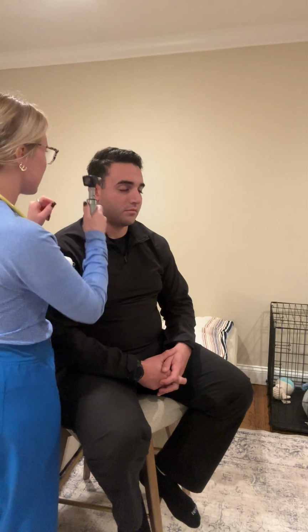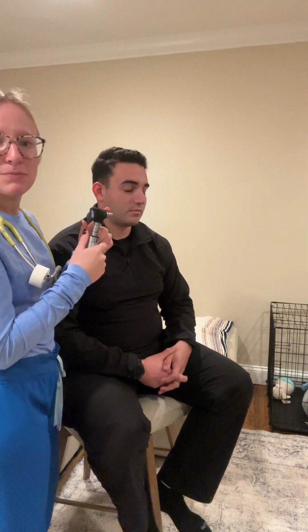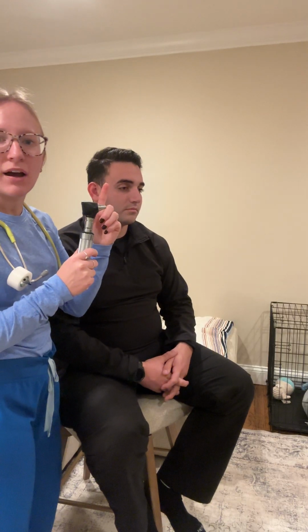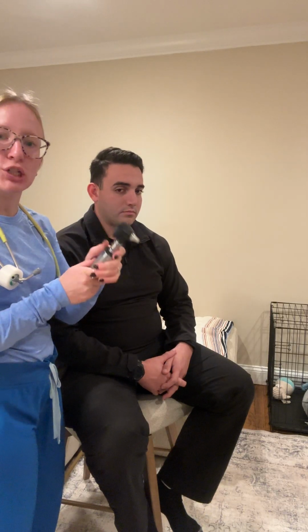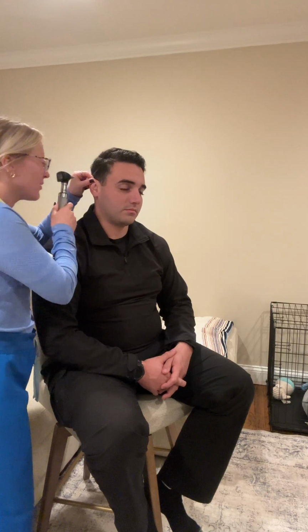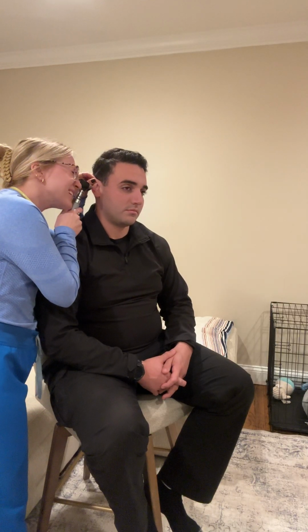So for the sake of the video, we are going to use our otoscope, and we are going to use the largest speculum. That way it gives him comfort, but we're not going to shove it into his ear. We're going to very gently place it in. So, like I said, we're going to pull up and back. We're going to view the inside. All right.